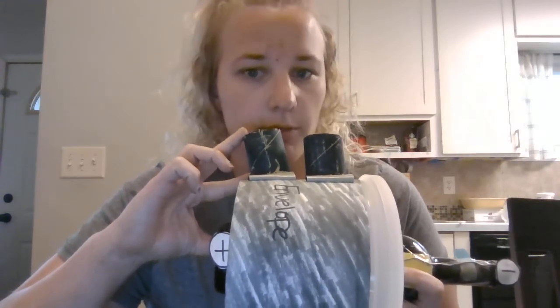This is a stator. It's the only part that is outside of the envelope, and it uses an electromagnetic effect to turn the rotor through the envelope, allowing electrical separation. If the stator doesn't turn, the rotor won't turn the anode, and that would cause melting spots on the target, because the purpose of rotating the anode is to dissipate heat.